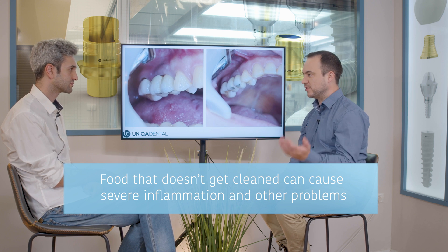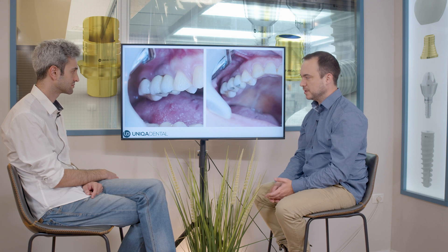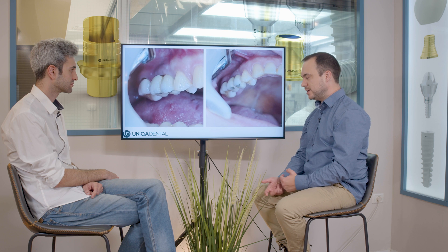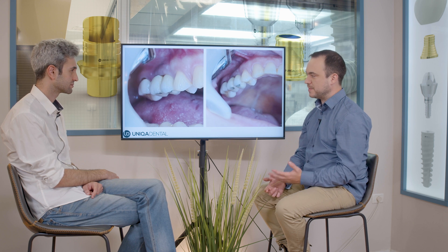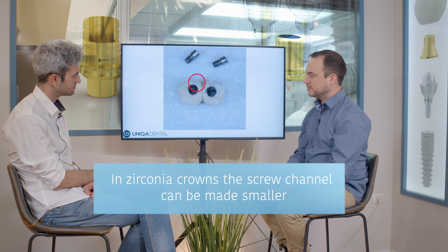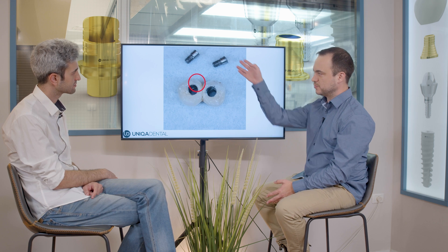We needed to take out those crowns, clean around the implants, and left it for a couple of days to heal up. The second thing we want to show is the difference between zirconia crowns and PFM crowns, because in zirconia crowns you can make the screw channel much smaller. This is the bridge made of two crowns with the two screws.